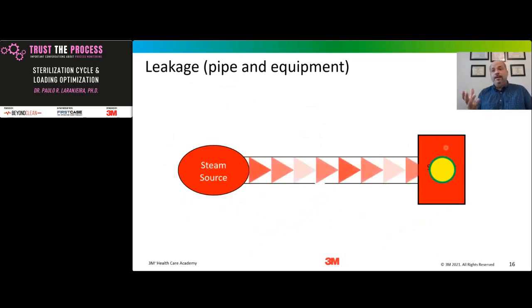The Bowie-Dick test is important. You need to do that Bowie-Dick with the cycle, with an empty chamber, to make sure everything is captured inside of that Bowie-Dick, which is going to be the coldest spot inside of the chamber during the test. But that does not guarantee that all air has been detected. The Bowie-Dick has a limit. So you might have an approved Bowie-Dick test, but if you go to your technical area where your sterilizer is installed, and if you see water in there, you're going to have this issue that I'm presenting here.